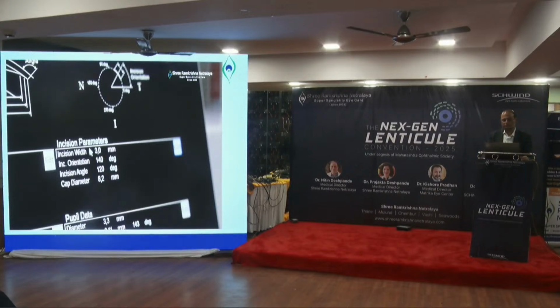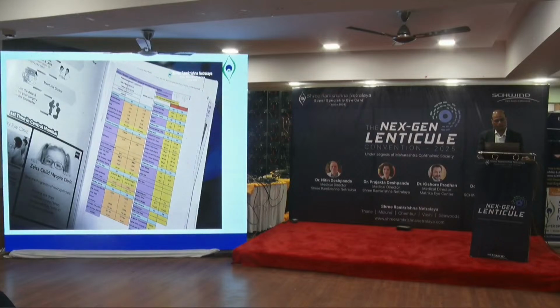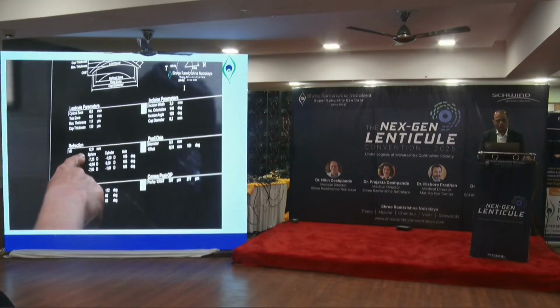Length of the incision is 3 millimeters, and we use this London Vision Clinic's nomogram, with which we overcorrect the patient according to his age. So this patient in the right eye has been overcorrected by plus 0.5. There is a London Vision nomogram, which again Dr. Kishore shared with us, and you basically make the patient a little more hyperopic than you want, because with the process of regression, the patient lands up with 0 in a week or 2. So again we tell the patient that reading might be a little strenuous in the initial phase, but things will get clearer over a week or 2.